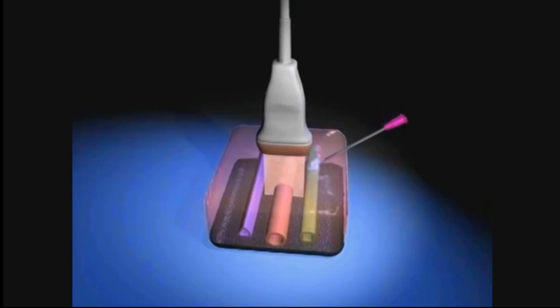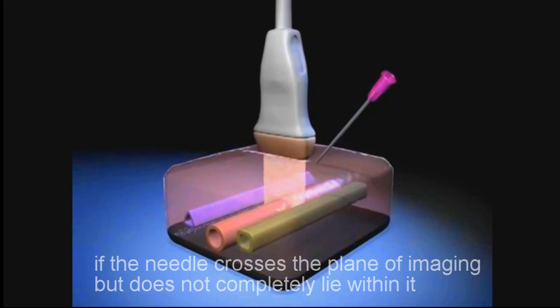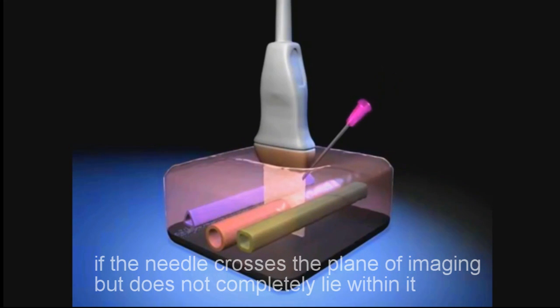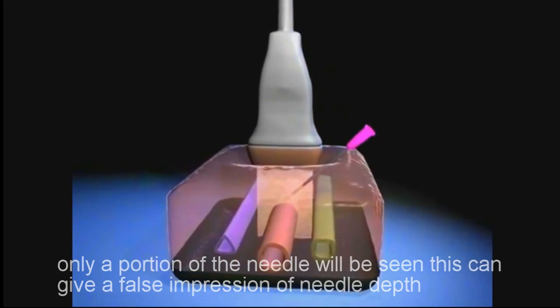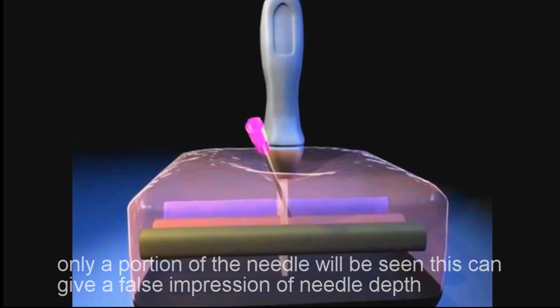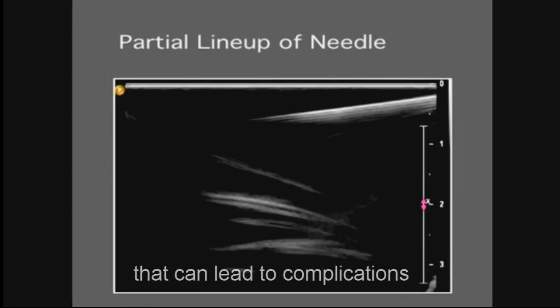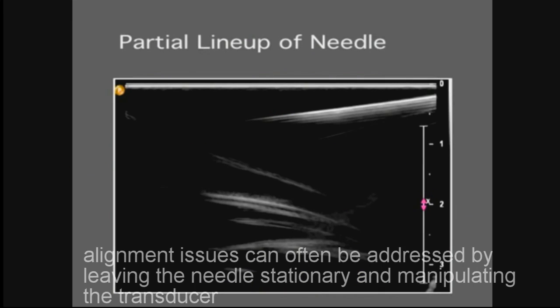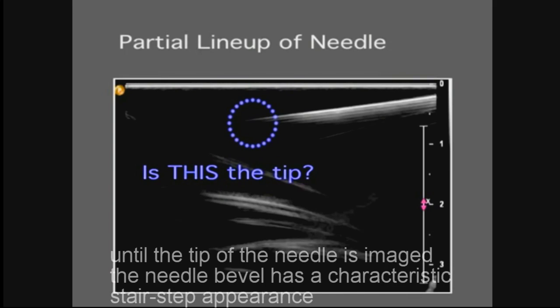If the needle crosses the plane of imaging but does not completely lie within it, only a portion of the needle will be seen. This can give a false impression of needle depth that can lead to complications. Alignment issues can often be addressed by leaving the needle stationary and manipulating the transducer until the tip of the needle is imaged.